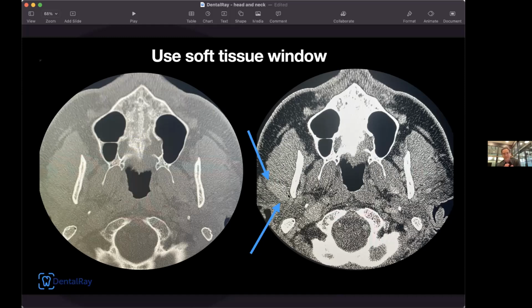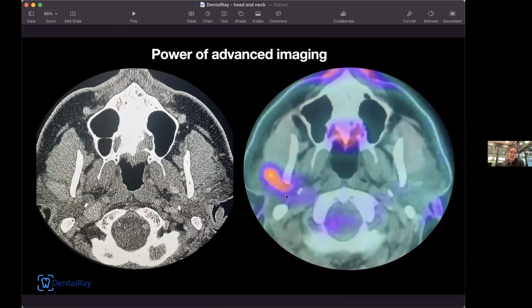And this is, as we referenced in the beginning, a critical space called the parotid space where pathology can occur. Most of the time on a cone beam CT with the larger fields of view being obtained, the parotid space is within the field of view. It's absolutely critical to evaluate this every time. And I'll move on here.